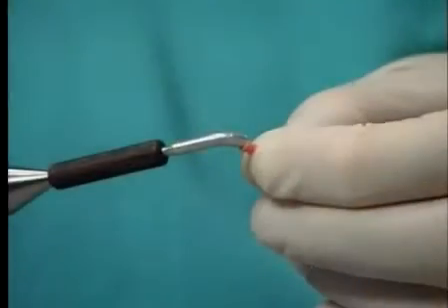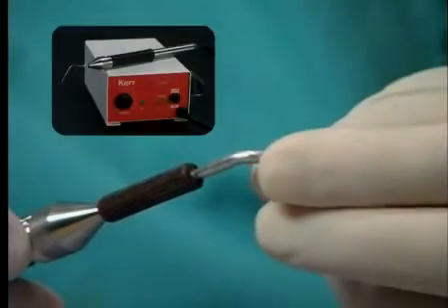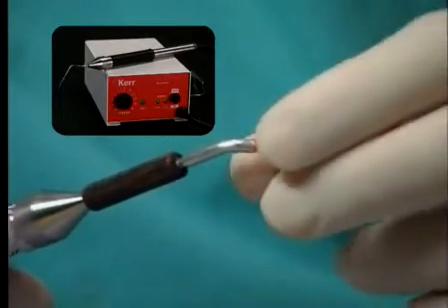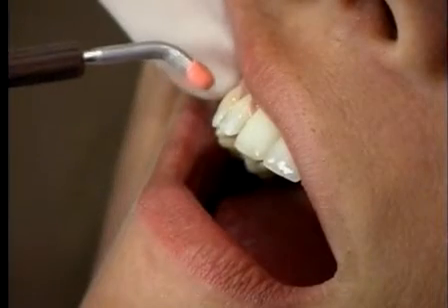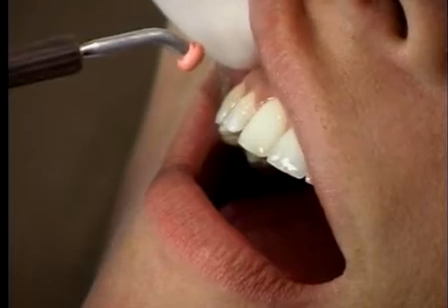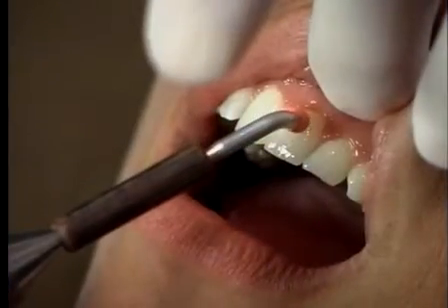When a patient reports sensitivity to heat, I like to conduct the hot test so that I can reproduce their chief complaint. A good way to thermosoften gutta-percha is to use Kerr's 5004 touch and heat in conjunction with the hot pulp test tip. Thermal softened gutta-percha is placed on the cervical aspect of the clinical crown. The teeth are left moistened to prevent sticky, tacky gutta-percha from adhering to the surfaces of the tooth.